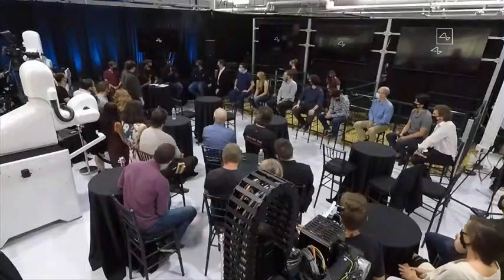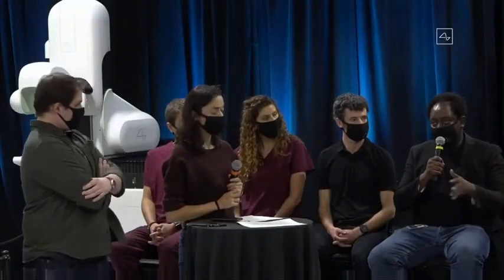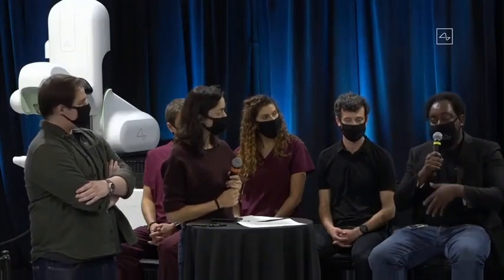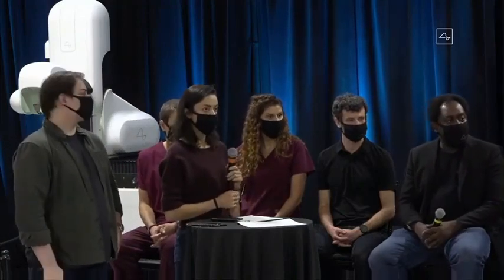So I just want to add to what you just said. The threads are actually also in the brain, and because of their thinness, they're very flexible. And so as the pig is moving around and banging their head, the threads actually move with the brain, even with the normal pulsation of the brain. That helps minimize stress within the brain tissue also, and that has a long-term impact on the functionality of the device. Zach, how long are the threads?